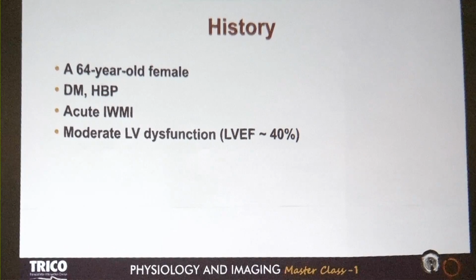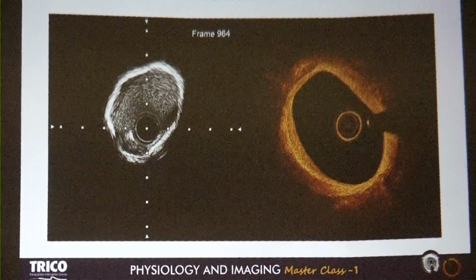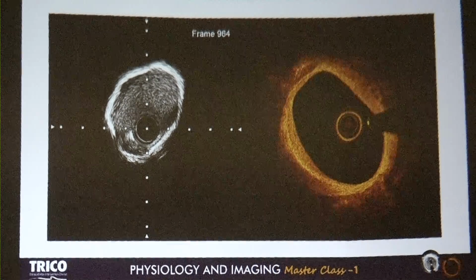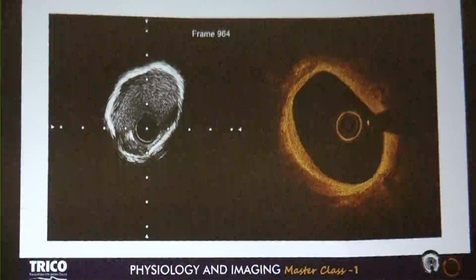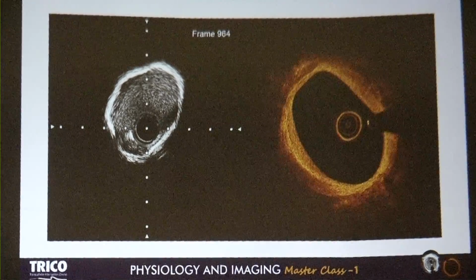And moderate LV dysfunction, and now I am throwing the IVUS and OCT image of the same area together. And it's dense fibrosis may mimic calcium on IVUS. I want the opinion of the panelists.